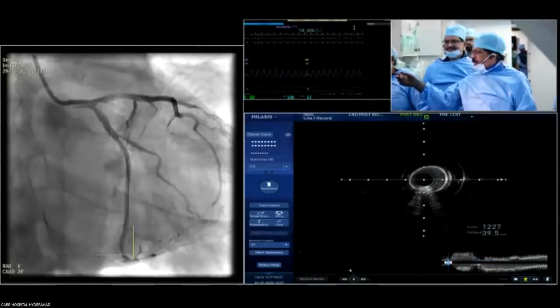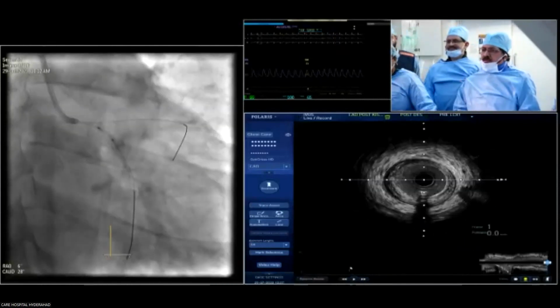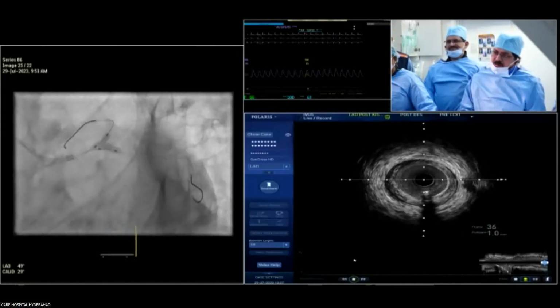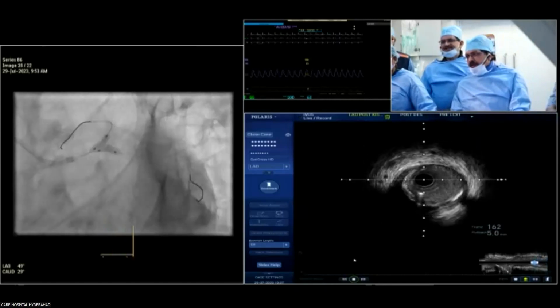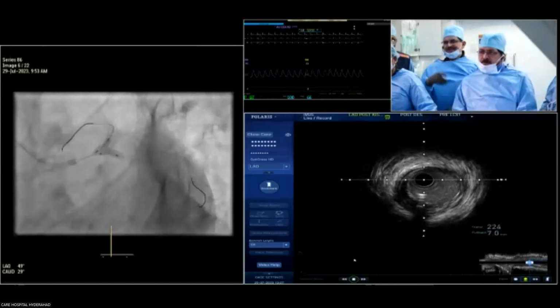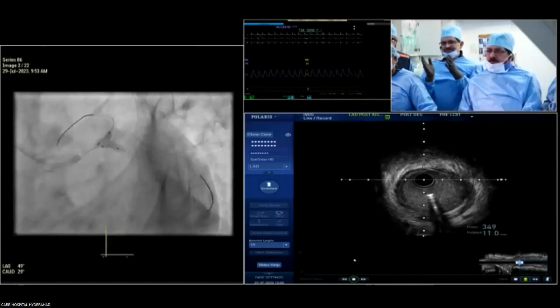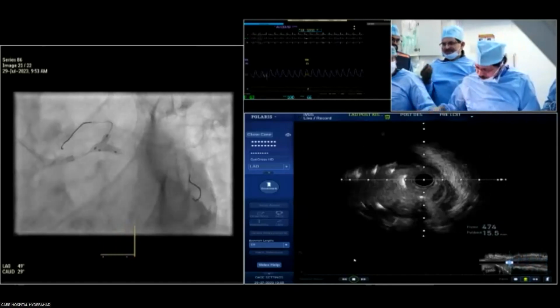And the question is, I guess, have we done a kissing? Does a kissing need to be done there? Let's answer that. Are you going to make that distal end bigger? Are you going to make the carina there bigger? Are you going to rewire into the LAD and open the struts? Which I see you've done. Actually, those struts were crushed and a kissing balloon was done. You can see that on the angiofilm and final IVUS, you can see the crushed portion with a 3 by 3 kissing balloon, whatever the struts which are projected.